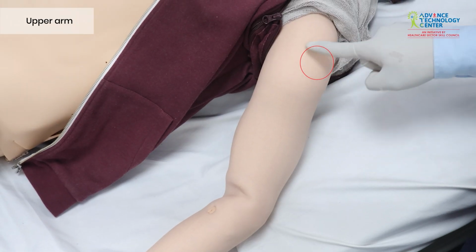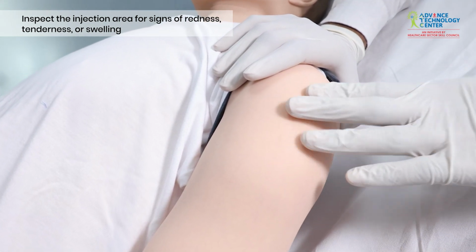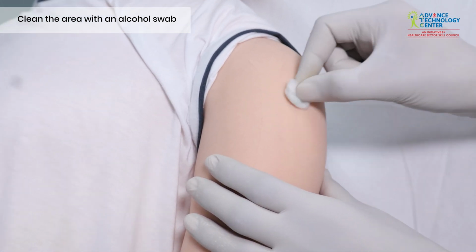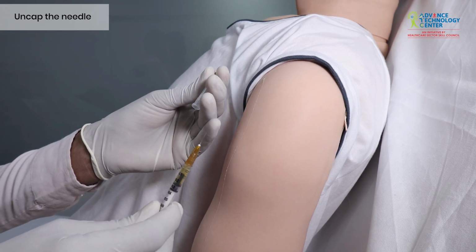Upper arm, relax by the side. Assess the site for swelling, redness, or tenderness. Clean the skin in a circular outward motion using an alcohol swab and let it air dry completely. Remove the needle cap using your non-dominant hand.